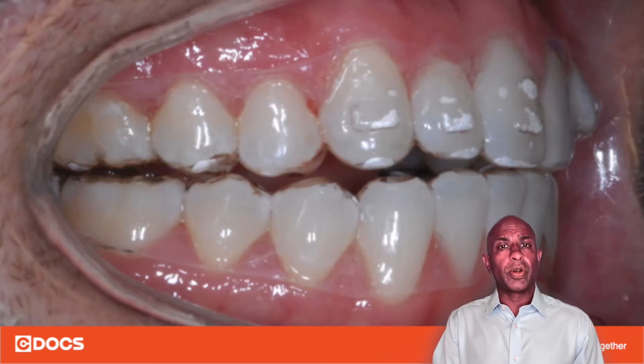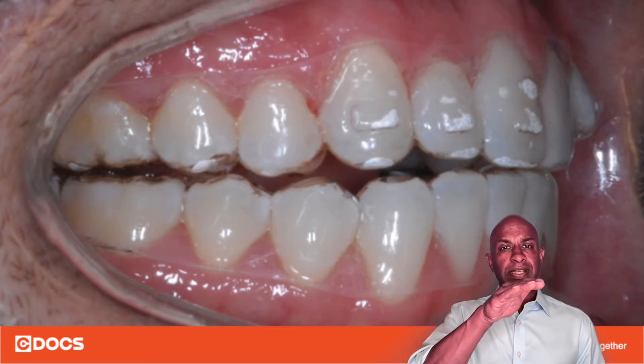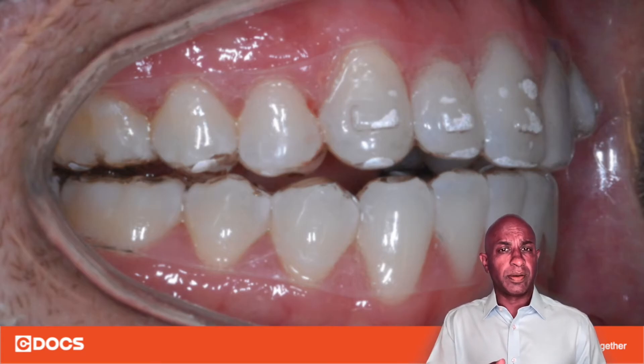Once you have loaded the composite into that negative well, you want to make sure that there is a slight bulge or over-bulking of the composite material such that it's convexly coming out of that attachment well. This will ensure that there will be enough material to be able to bond to the actual tooth.